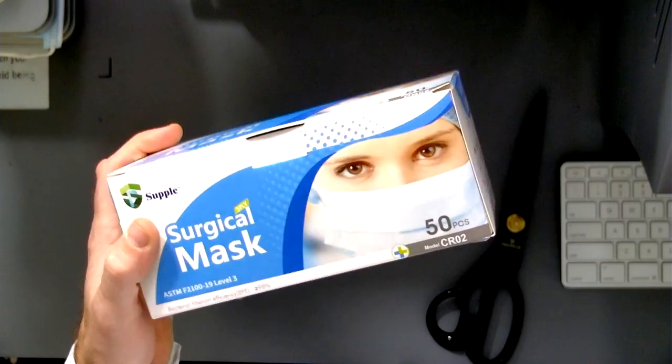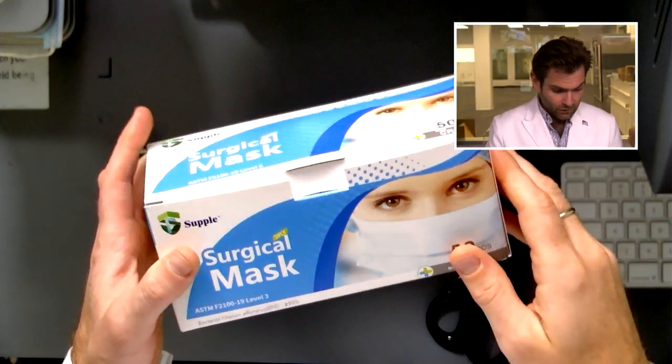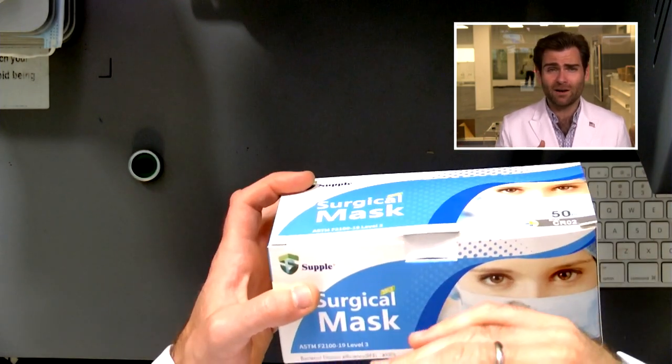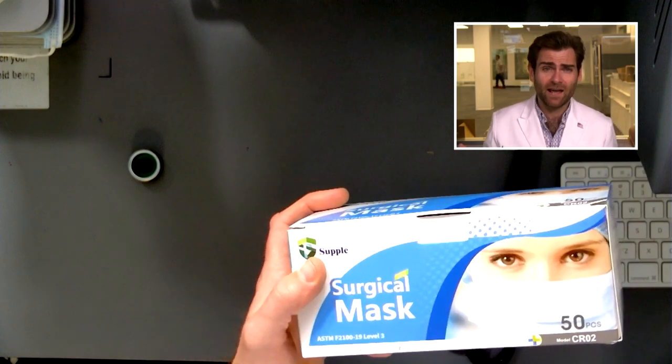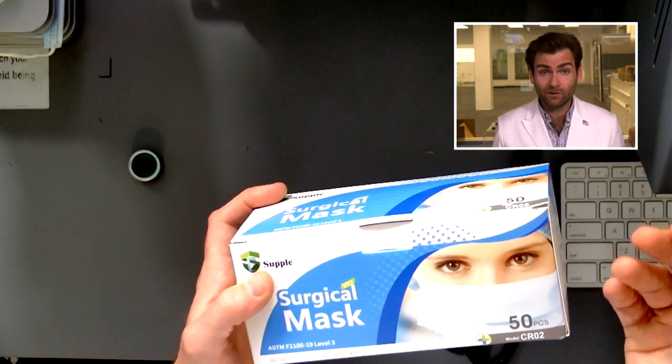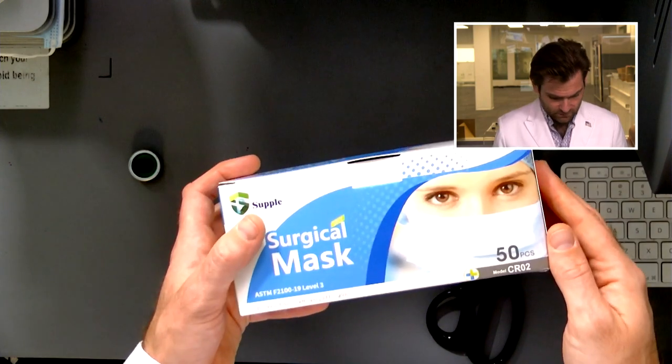Let's look at the box here. We had to reach out to the manufacturer. What we did is we went to the FDA's website — there are only about 100 manufacturers that have a cleared mask. We found them all, and the ones that weren't on Amazon we reached out to and asked for a sample.